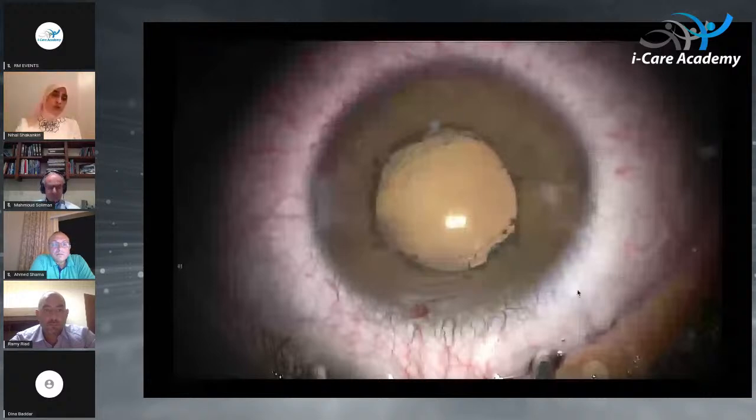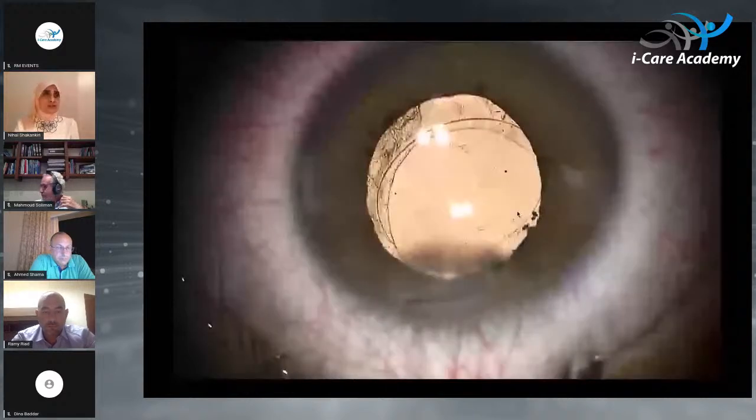And in these cases, again, the posterior capsulorhexis should be exactly 4 in order to inject the IOL in between the two rexes. And it's a must to implant the IOL inside the capsular bag, because the IOL acts like a foreign body, and you don't want to touch the back surface of the iris, so as not to increase the risk of cystoid macular edema. This is another case with band keratopathy and posterior synechiae.